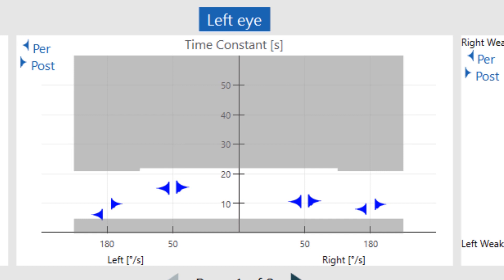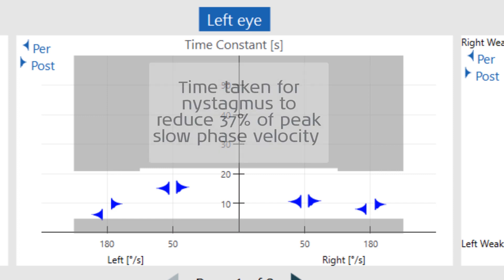The most diagnostically significant parameter in the step test is the time constant, which again is the amount of time it takes for the slow phase velocity of the nystagmus to decrease to 37 percent of its peak velocity. Reduced time constants may be associated with unilateral or bilateral vestibular pathology, or even central vestibular involvement.